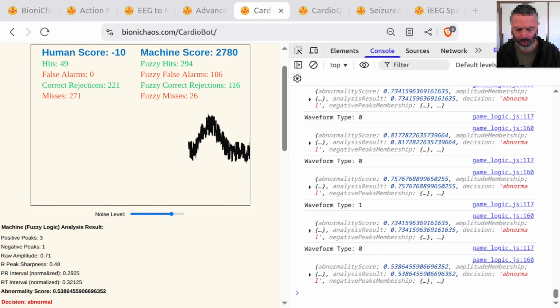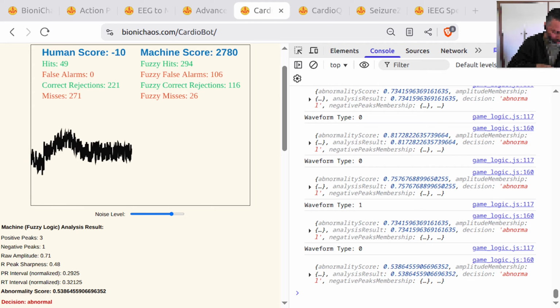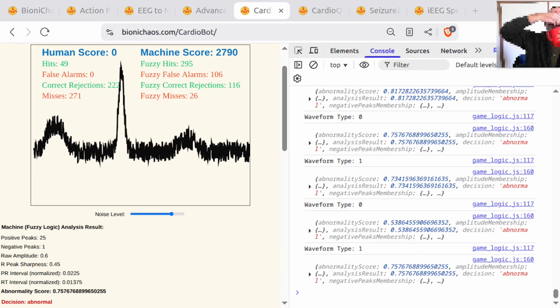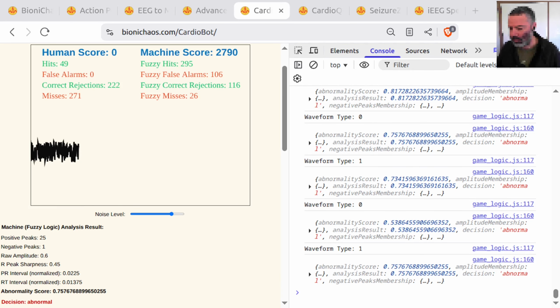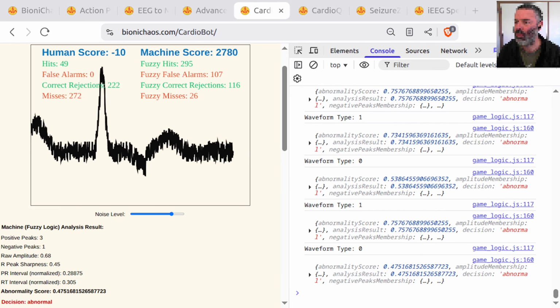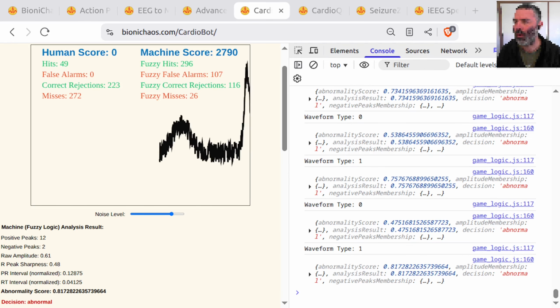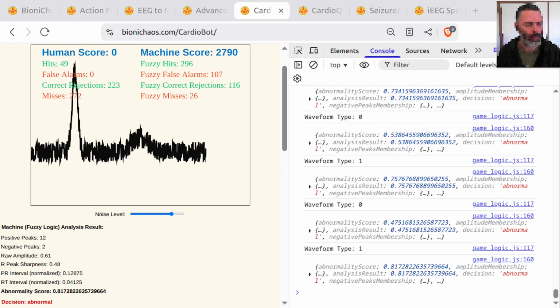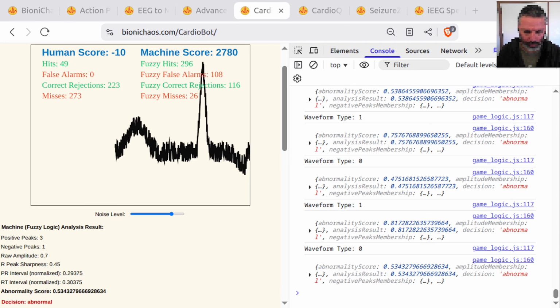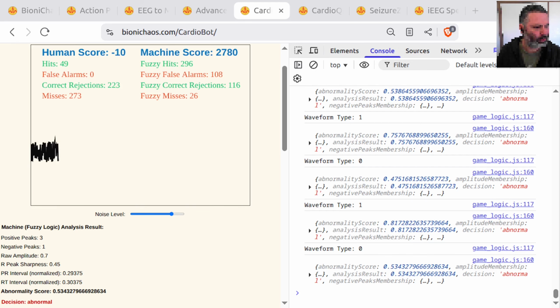Because JavaScript engines like V8 are so aggressively fast now, implementing this logic directly, running it on the client's processor, will be faster than sending the data over the internet. So we're not waiting for a pre-compiled Python library. We're using the user's CPU to execute the custom peak finding code. This gives us complete control over the performance. The R-peak sharpness calculation, finding the width at half max, is just basic array indexing, which is trivial and instantaneous in JS. The fuzzy logic solution.